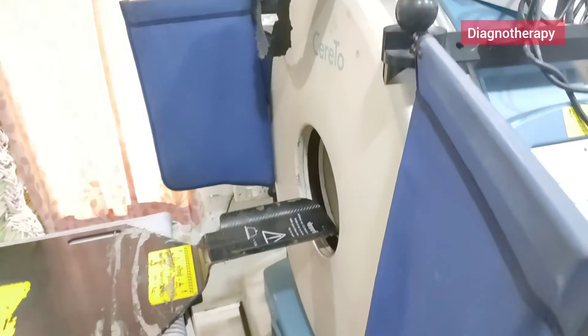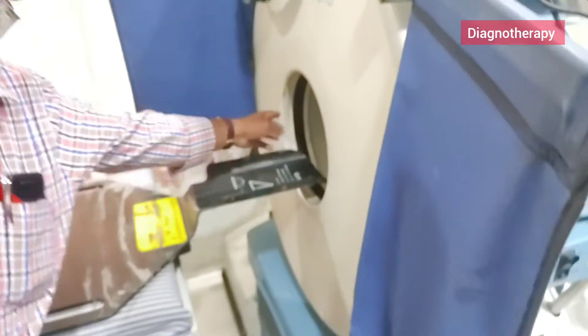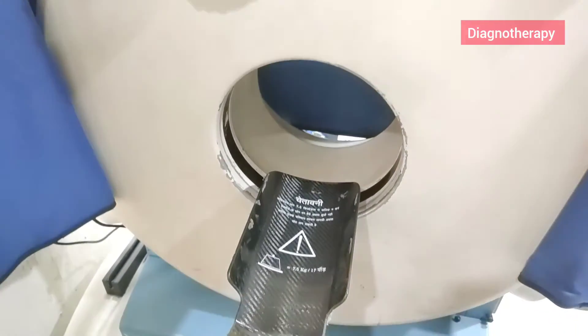This is a portable CT scanner. With this, only head scan and neck scan can be done. You can see the gantry here. A new thing is that the table doesn't move.